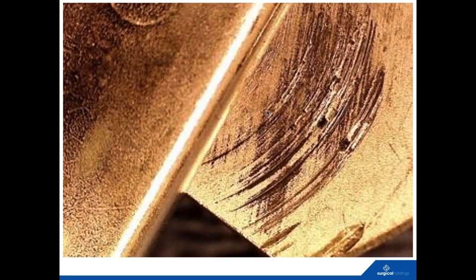You get this type of corrosion on different joints. It can be box joints. This is a very zoomed-in image here. But what happens is, and it's again something to look out for, sometimes this will naturally happen in scissors. This isn't something you will ever avoid, but it's something to be aware of: once a scissor starts to bed in, and if you're working a scissor, it can cause these score marks. Using lubricant can avoid it. What we don't want is the surface getting really damaged and starting to corrode or rust.